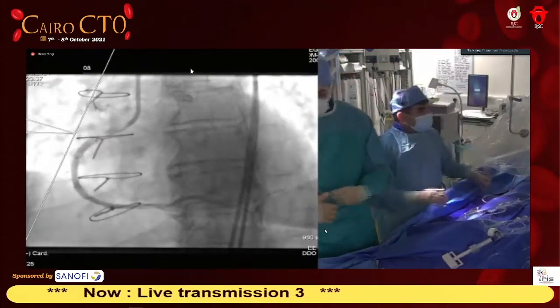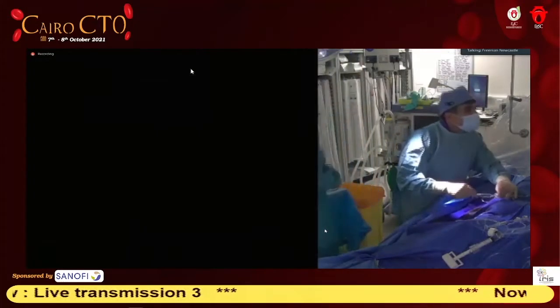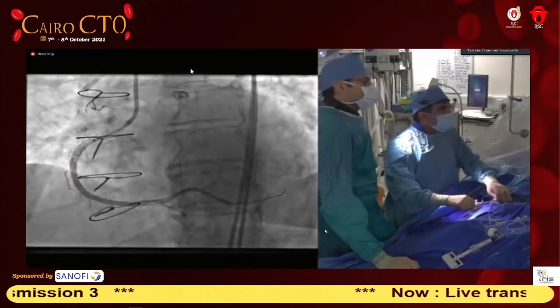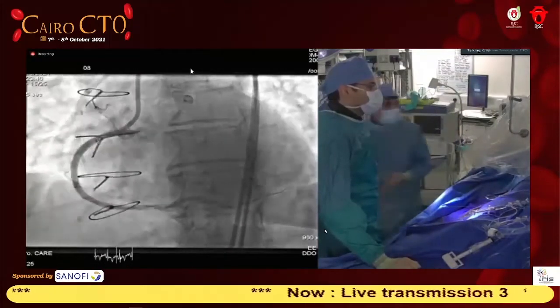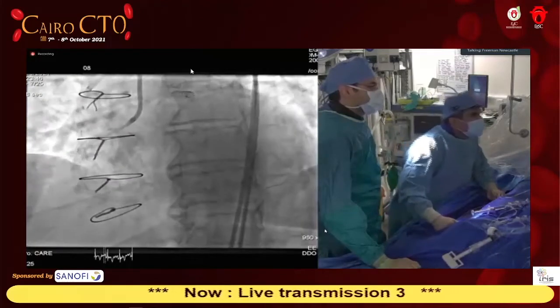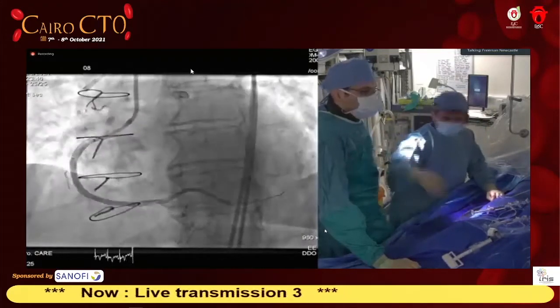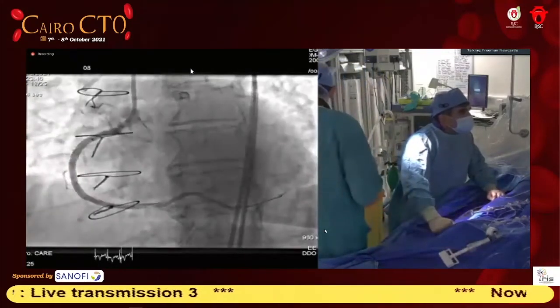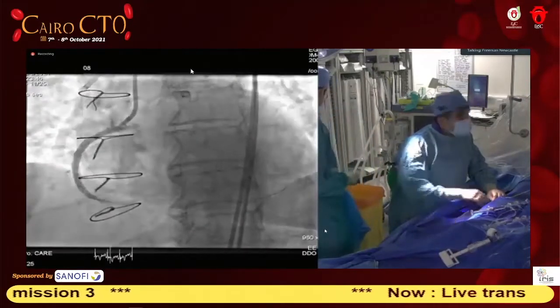Can I have a 3-0 by, actually, I need to take a cine. I can't see very well here. Yeah, 3-0 by 38. 38 will be very long. See the hematoma? Yeah, I think it's maybe, well, actually, it's too long. 33 will do. 3-0 by 33, sorry. Okay. Yeah, you could see the hematoma or the dissection caused from before.